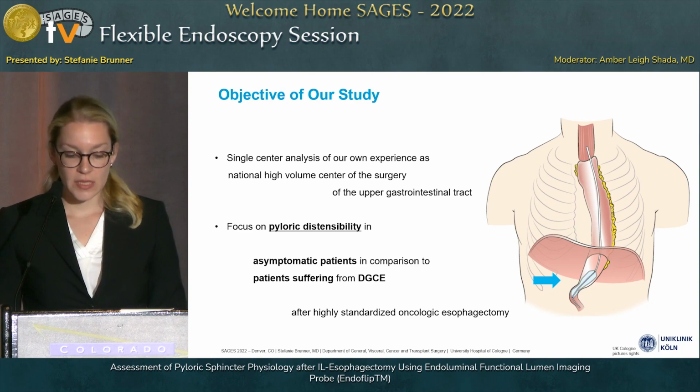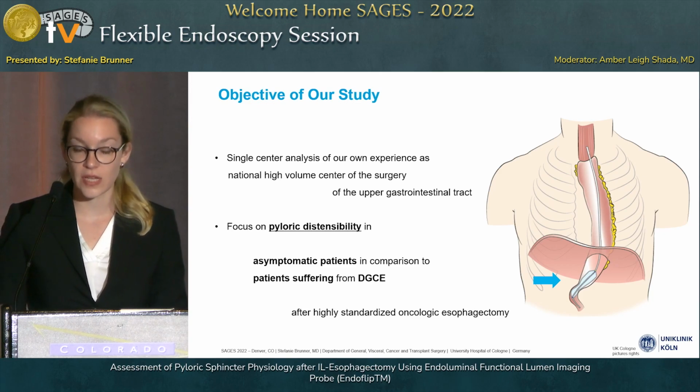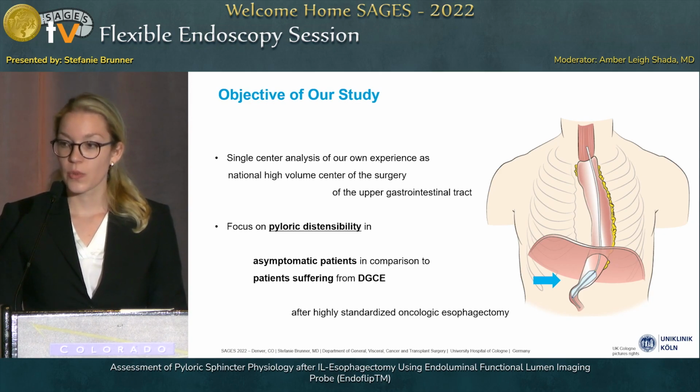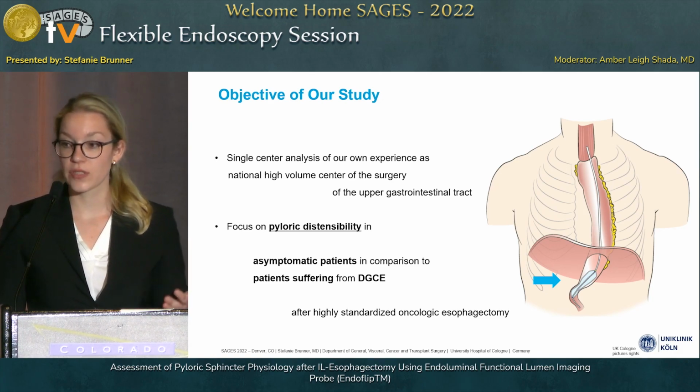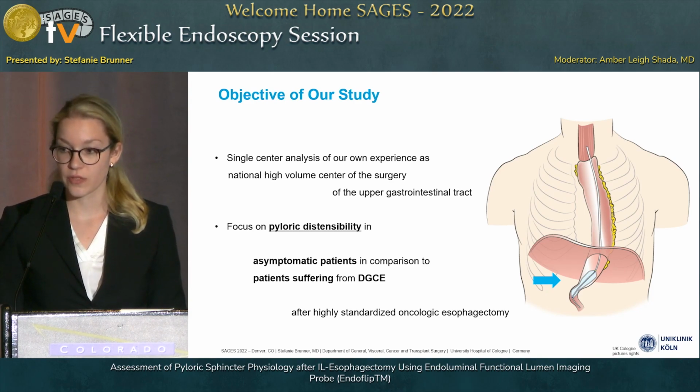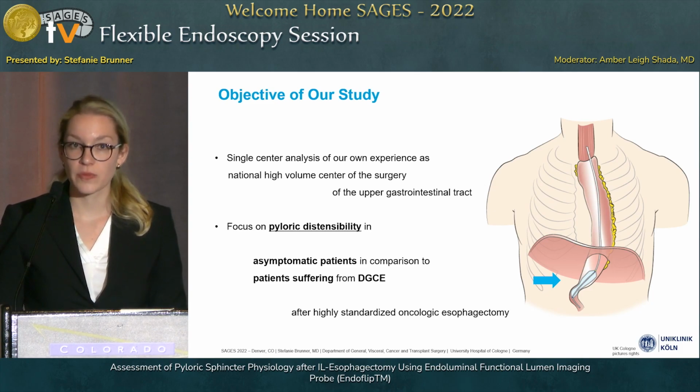So we performed a single-center analysis of our own experience as a national high-volume center for surgery of the gastrointestinal tract. We compared patients suffering from DGCE after esophagectomy to asymptomatic patients, also after esophagectomy, in order to know if the Endoflip measurement is feasible.